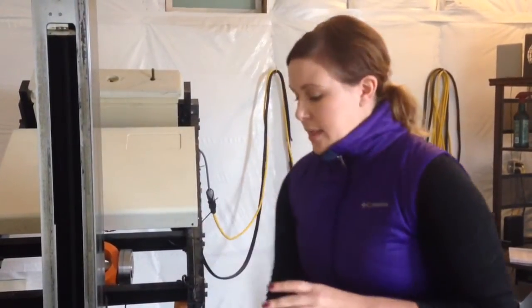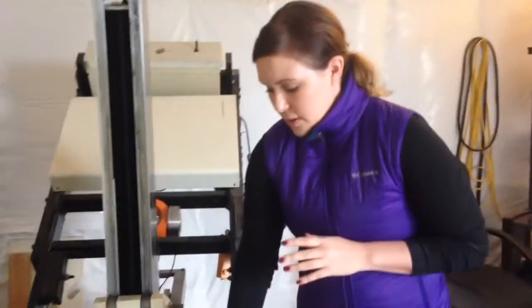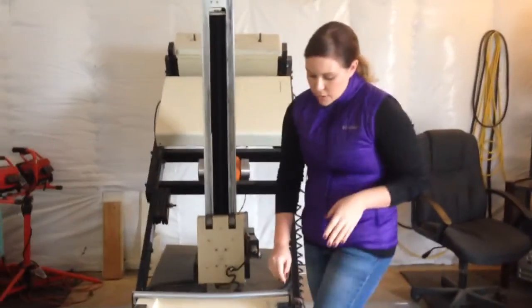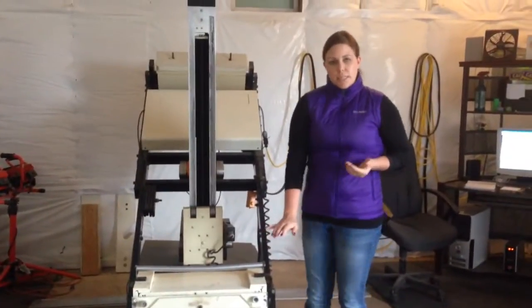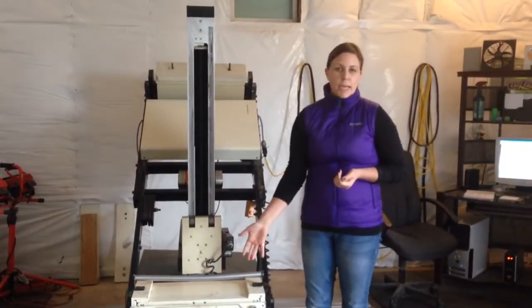After we inject the isotope and it travels to areas of bone inflammation, the horses wait in their stalls while it settles — usually about two hours. Then we bring them in and they stand right in front of this camera. For front leg images the horse just stands right here; they're usually a little sedated but enough to stand quietly.